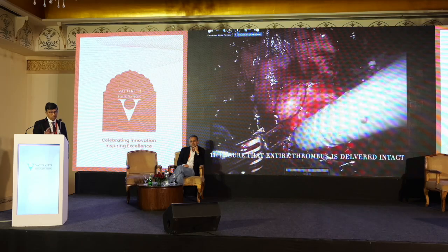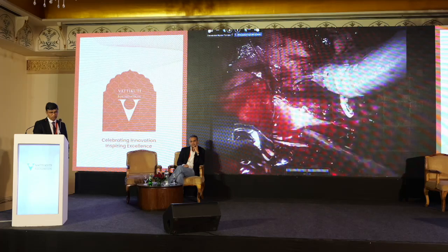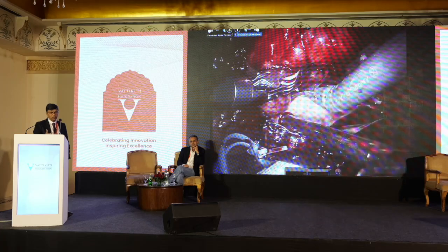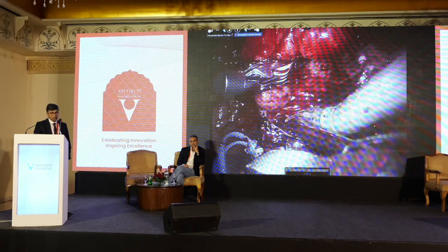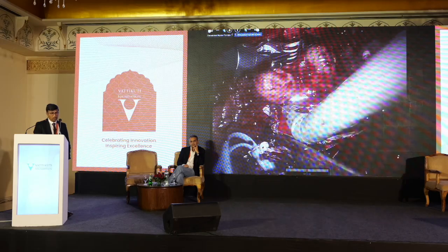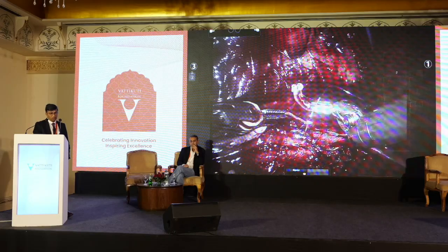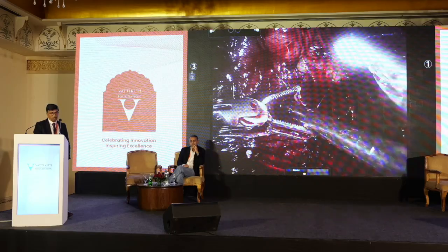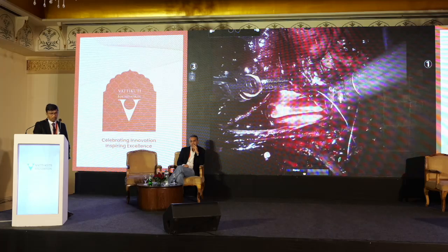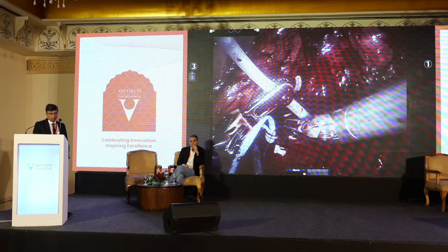Here you can see the thrombus is completely intact and smooth. So the thrombus is clearly seen, which is probably an ideal case to do it. Otherwise, as somebody pointed out, with infiltration of the IVC and sticky thrombus, I don't think we should really attempt such a procedure, because you don't have control of tumor spillage and things like that, which may be oncologically devastating for the patient. Again, we are using Prolene here. This is a 5-0 Prolene, but I agree that Gore-Tex is a better choice for repairing the IVC.